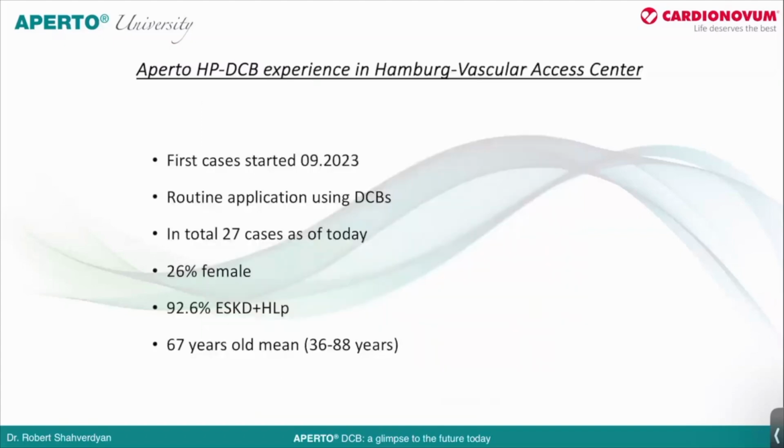There was also an interest to see whether the balloon itself can change the outcomes of the patients based on the pressure, because we know that good vessel preparation is something that our dialysis accesses require prior to drug-coated balloon application, because the drug-coated balloon is not intended to treat the stenosis, but to extend the target lesion patency rate with its drug.